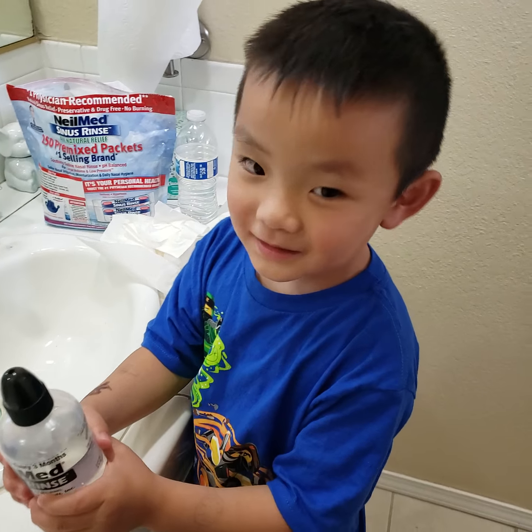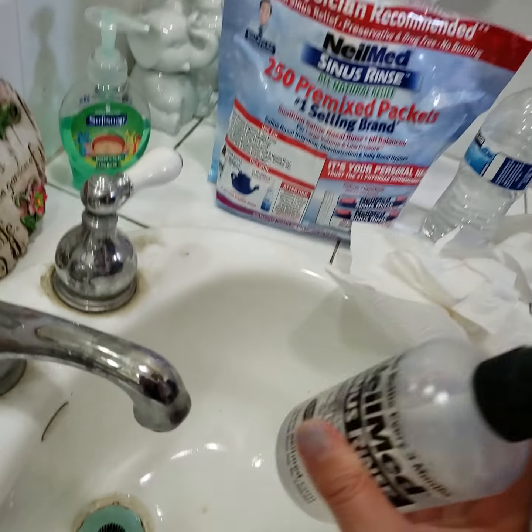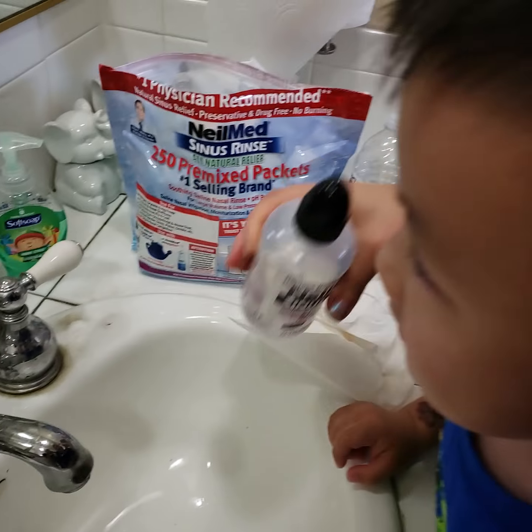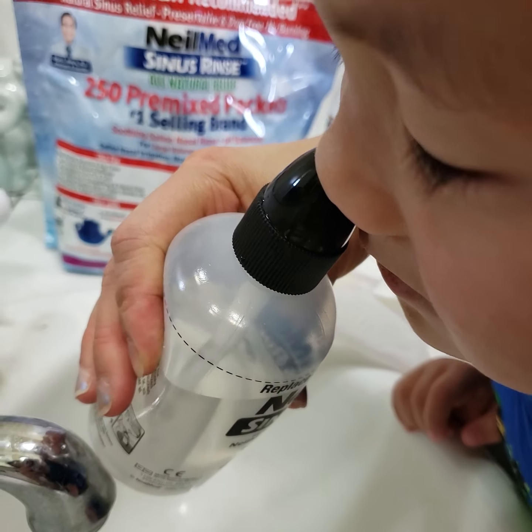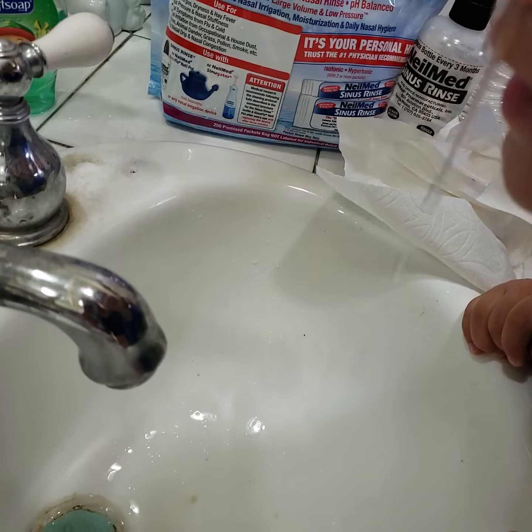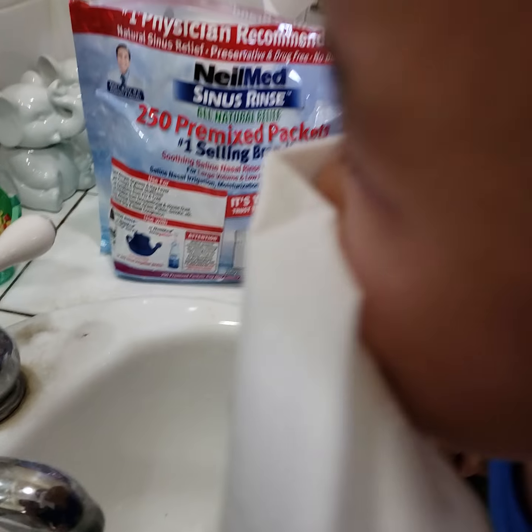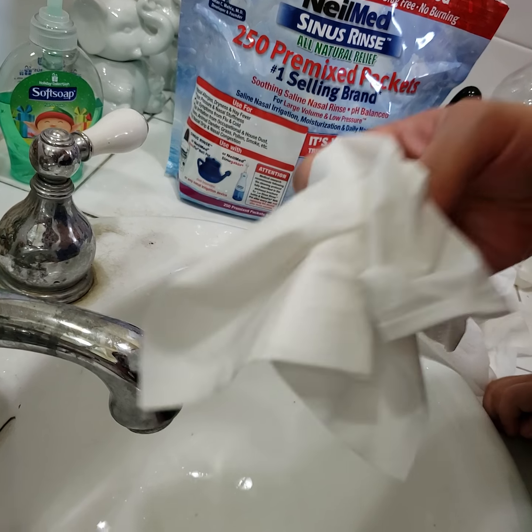Are you ready, Solar? Yeah. Okay, we're going to use the same one since we didn't finish. I'm going to put it on this side. Don't move. You got it? Okay, ready? Let me see. Better? Don't move. Don't drink it. Do you drink it? Blow. Oh, look at all these boogers coming out from you.